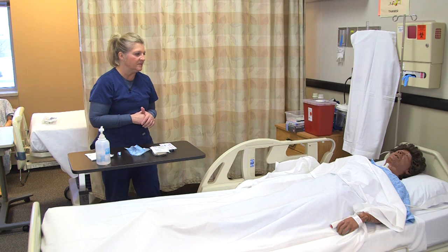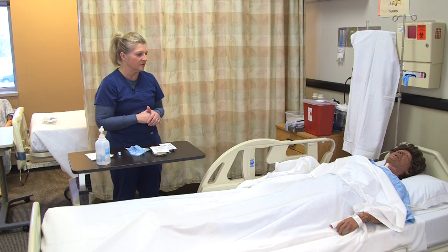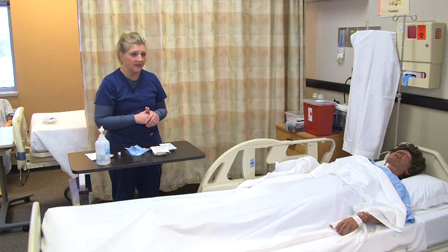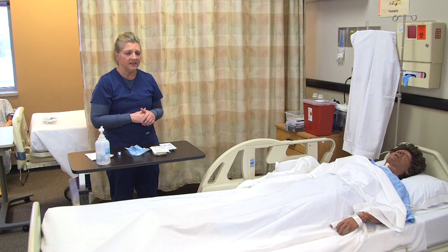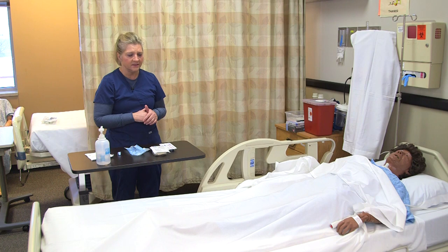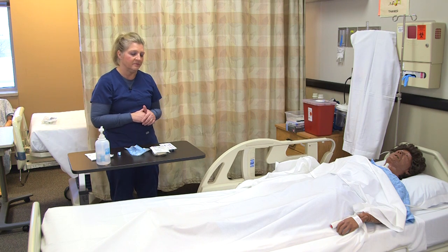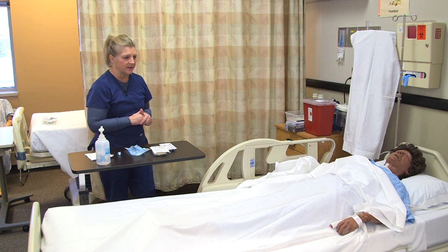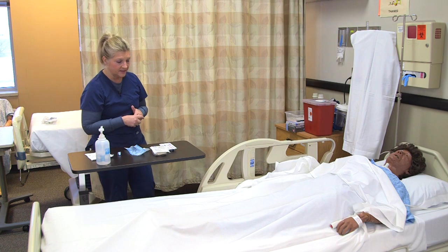I look at the patient's past medical history to make sure this is appropriate to perform. I also want to make sure the extremity I choose for the IV is free of any circulation problems, stroke paralysis, lymphedema, or perhaps issues from mastectomy. I'll note all that before choosing the extremity, and will go to the other extremity if any of those are present.